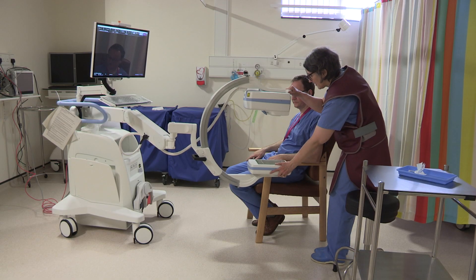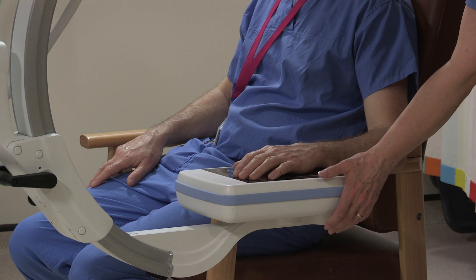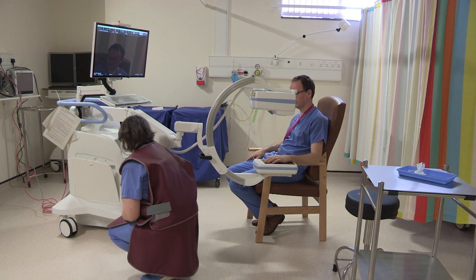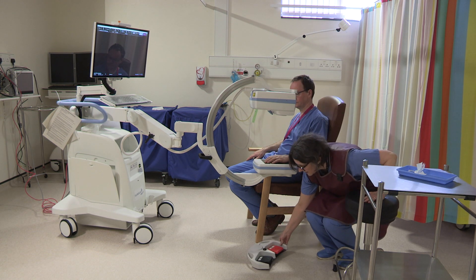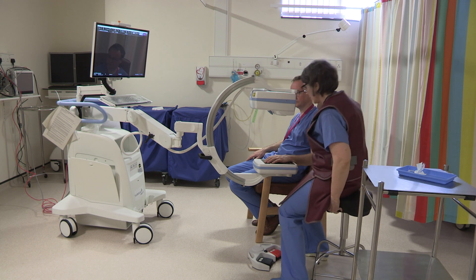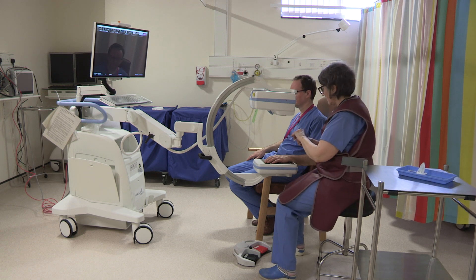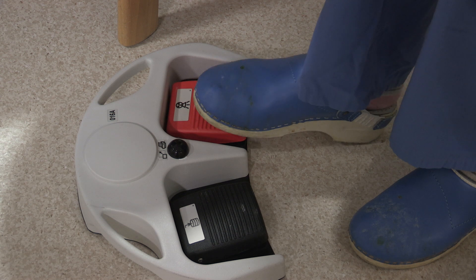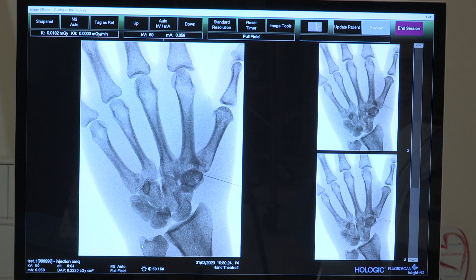Your employer is legally responsible for ensuring that the machine is maintained, fit for purpose, there is correct staff protection available, and that the area that the image intensifier is to be used in is appropriate. When you are using the machine, you take on the role of an operator. You take on a legal responsibility to ensure that standard operating protocols are in place, and you are responsible for the protection of staff working with you as well as protection of the patient.